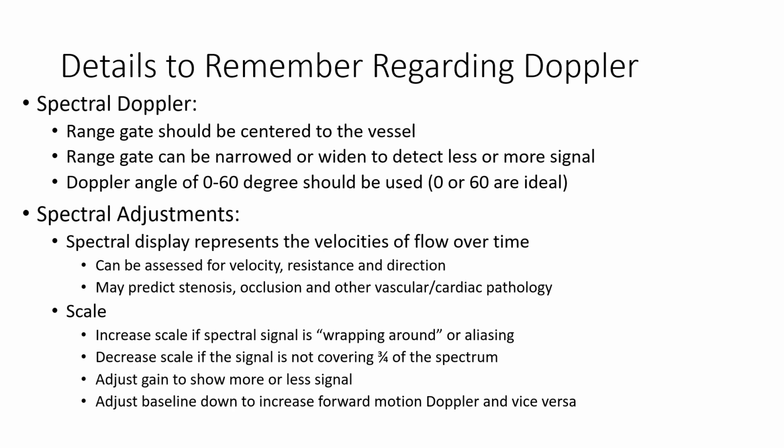That brings us to scale. So as you have your spectral Doppler running, you might see that the waveform is only taking up half of the graph. In that case, you'd want to decrease the scale to spread that waveform out, making it easier to assess.